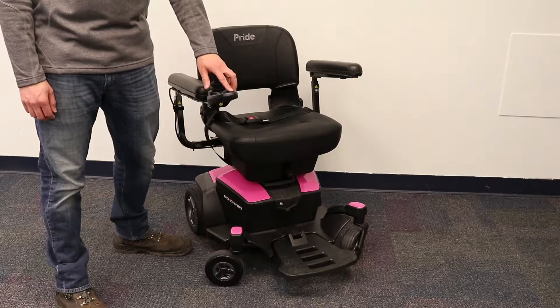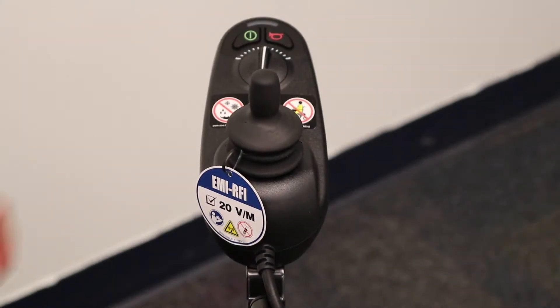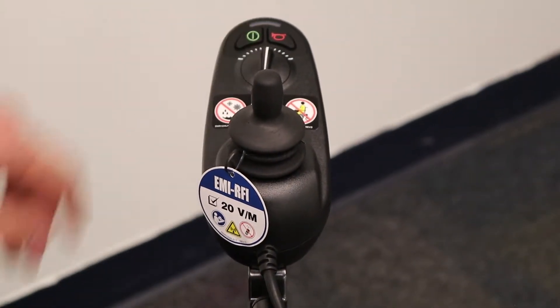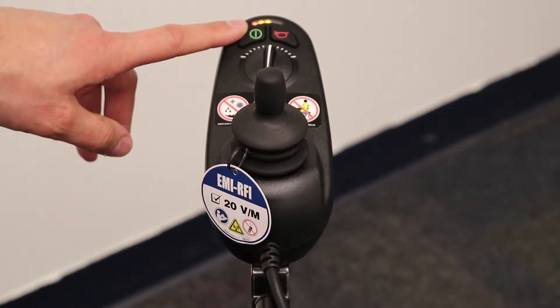First, let's go over the operation. To turn the power chair on, you have a green button to press on the joystick. The joystick will then light up, indicating the amount of battery you have left.